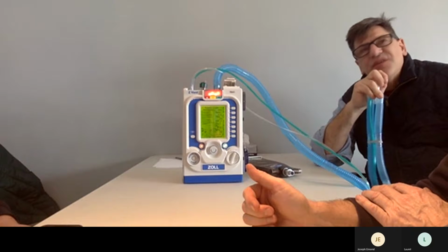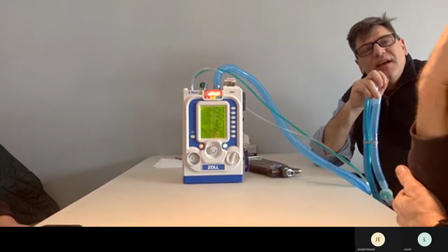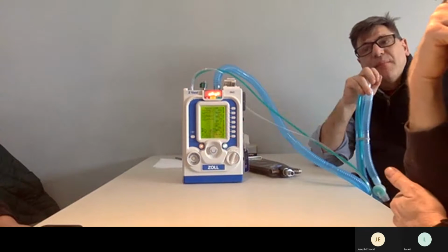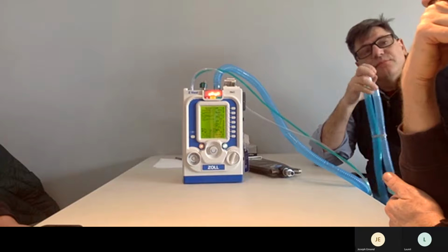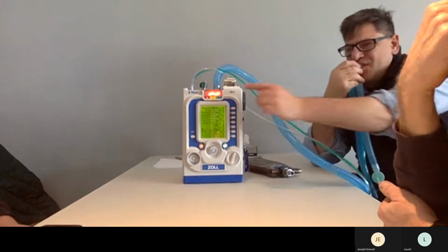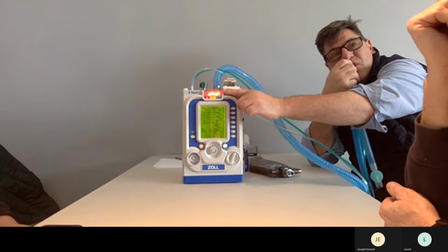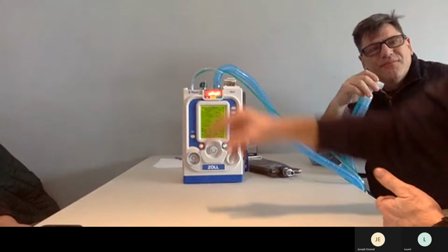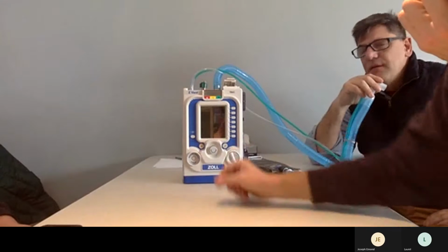And next to the word mode, you see where it says LC? Yeah, it's crossed out. That stands for leak compensation. And right now, the leak compensation is turned off. So with that hole, it's not able to compensate. Right, because you need a perfect seal with CPAP. Breath volume low. So even though it's within 2 minutes, it won't alarm, but the red light will still show. So turn it off.